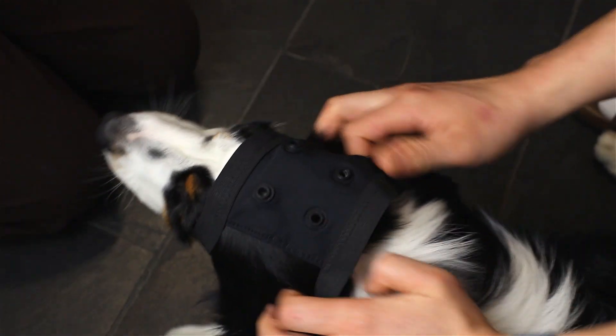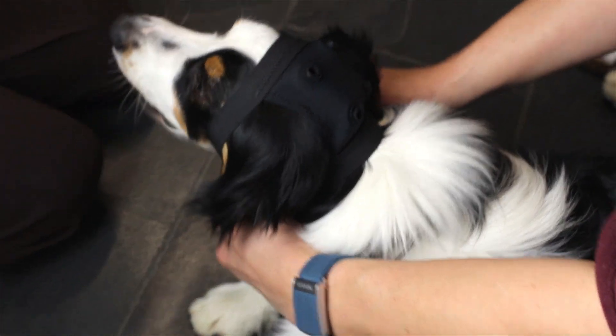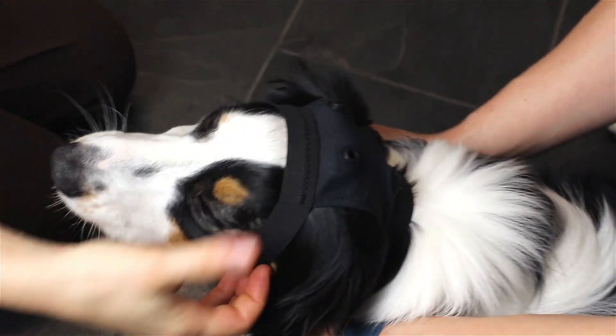Place the cap securely on the dog's head, ensuring a proper fit. Tighten the strap to hold it in place and check that it is positioned correctly.